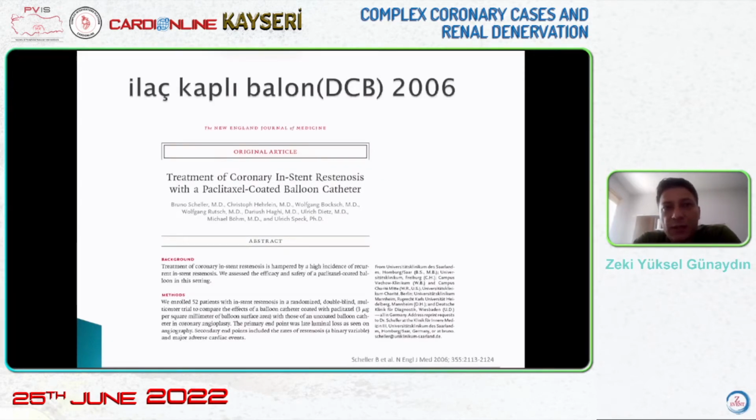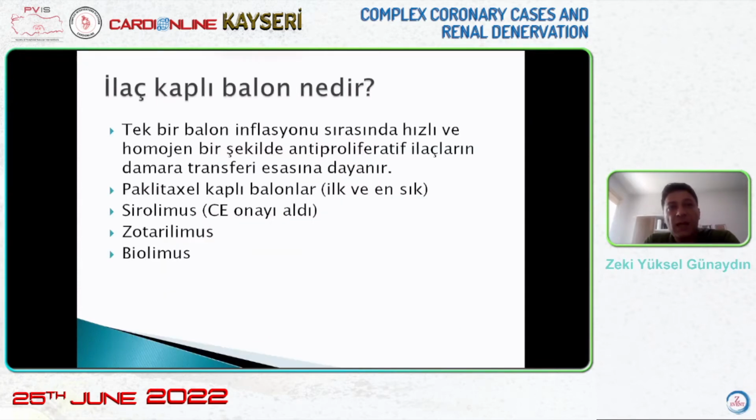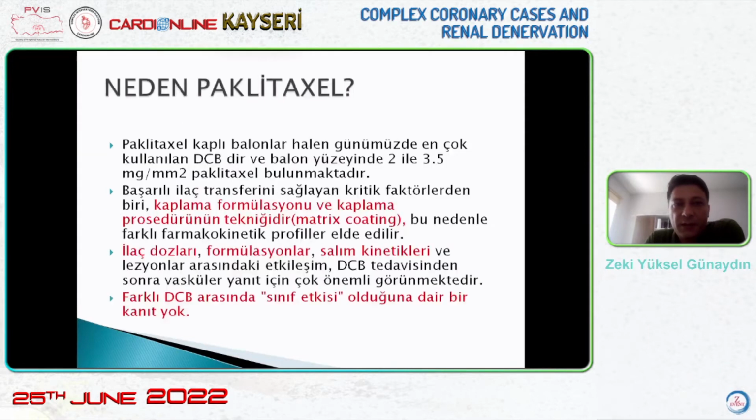DCBs came into our life in 2006, compared with in-stent restenosis, and it was very successful. What is it? The drug-coated balloon. Antiproliferative drugs are transferred to the vessel wall. Paclitaxel-coated balloons are the most used ones.